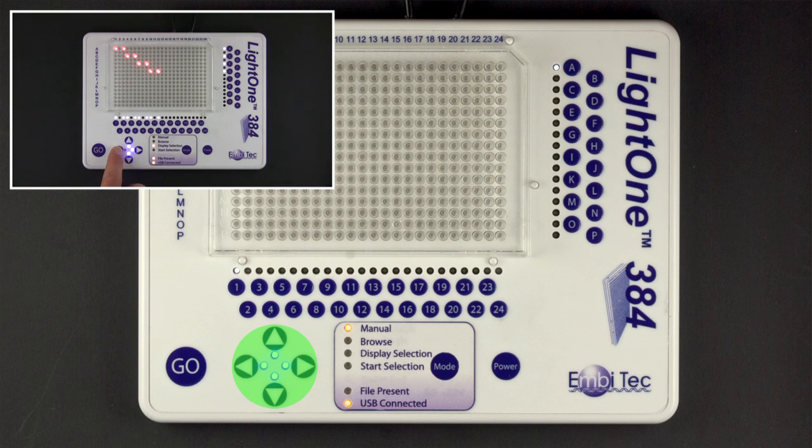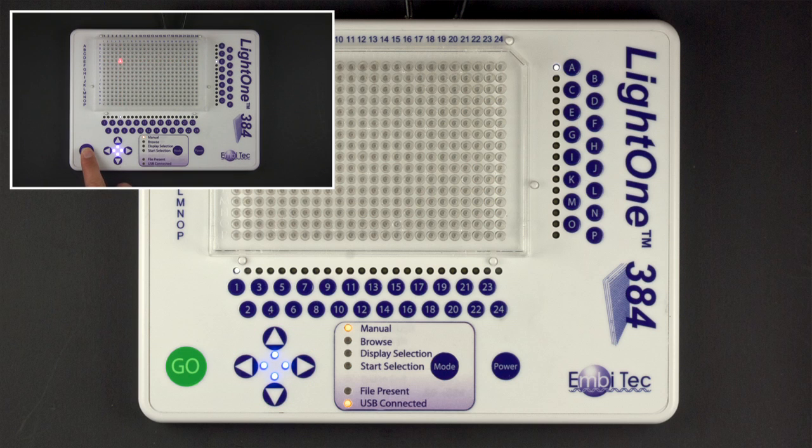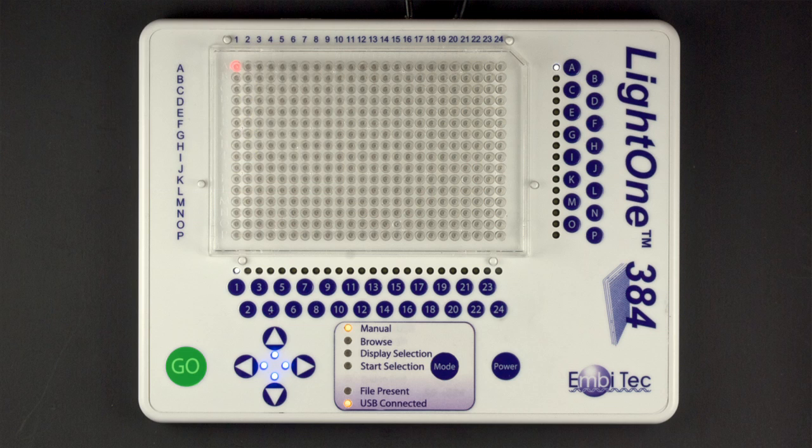The Go button is used to confirm selections in manual mode, and to step through templates in USB mode. When the end of a template is reached in USB mode, the full pattern will display again.